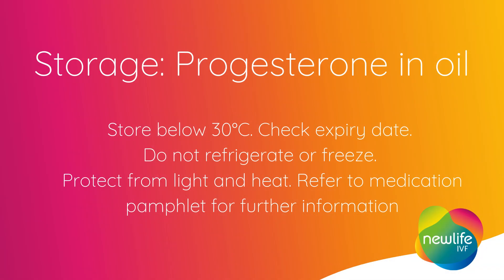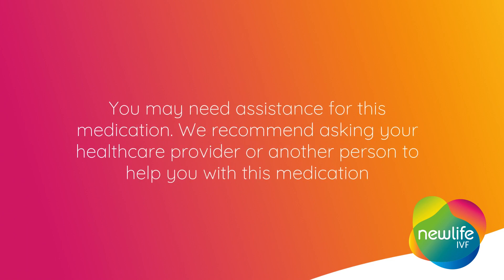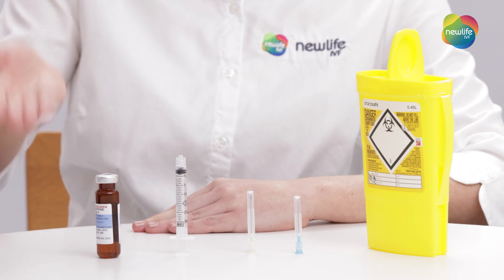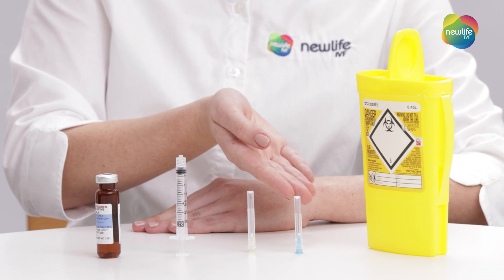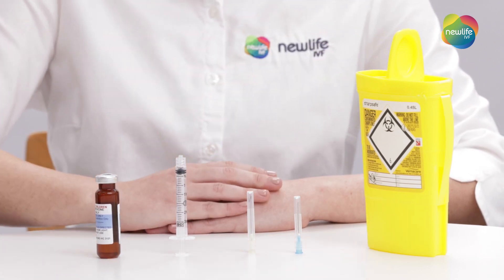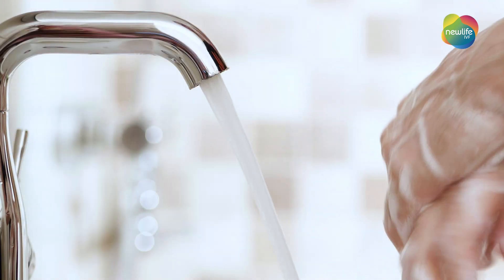Before we begin, let's prepare. You'll need your progesterone in oil vial, syringe, 19 or 21 gauge drawing up needle, 23 gauge needle to administer the medication, and your sharps container. Wash your hands with warm soapy water and dry thoroughly.